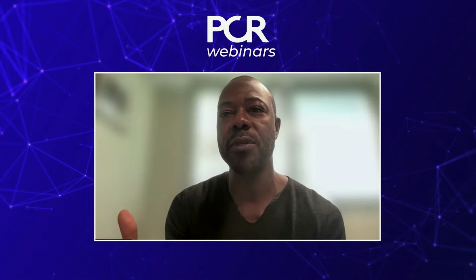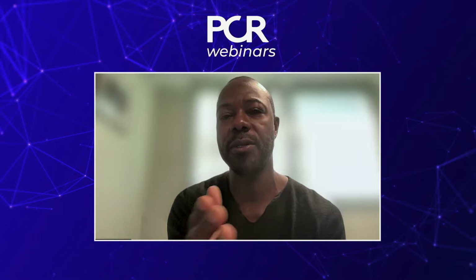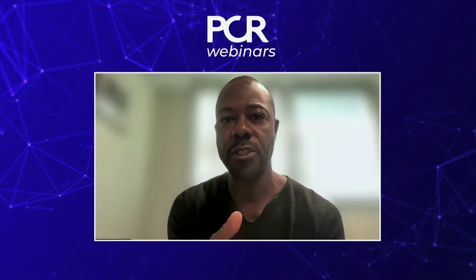But the very first question that I would like to ask you both, starting with you, Mike, given the challenges of this small aortic annulus, that is really one of the focuses because it's been discussed based on the results of the SMART trial that may promote the use of a self-expanding supraannular platform in very small aortic annuli. How would you summarize the main challenges when it comes to planning the procedure, what are the complications that you could anticipate for a small aortic annulus, for our friends who are not as experienced as you are in performing TAVI?